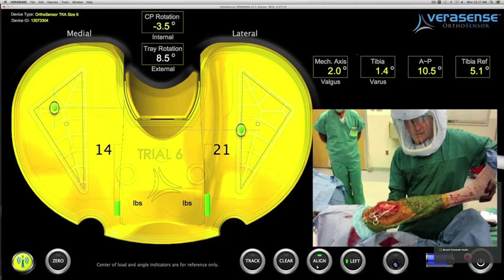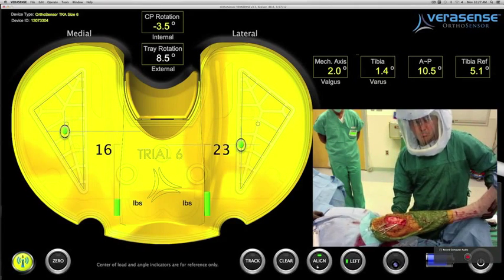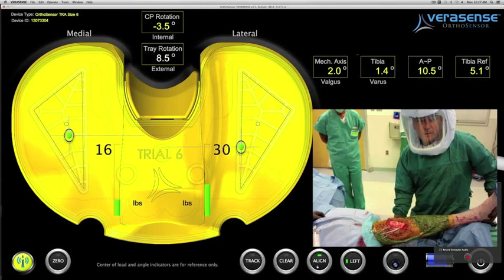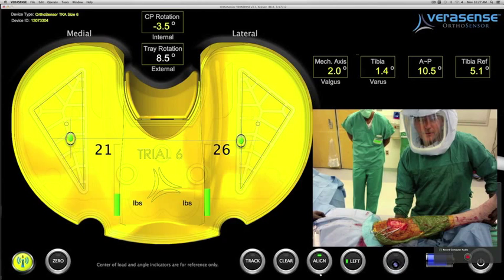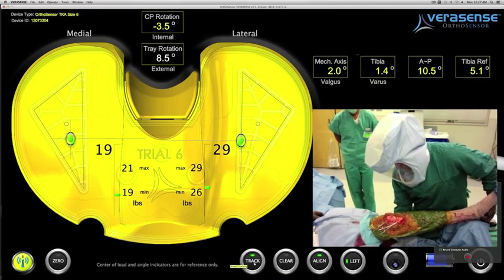In full extension, his intercompartmental loads are improved and balanced. The surgeon will then do a fine-tuning on the medial collateral ligament in the mid-flexion and flexion position.